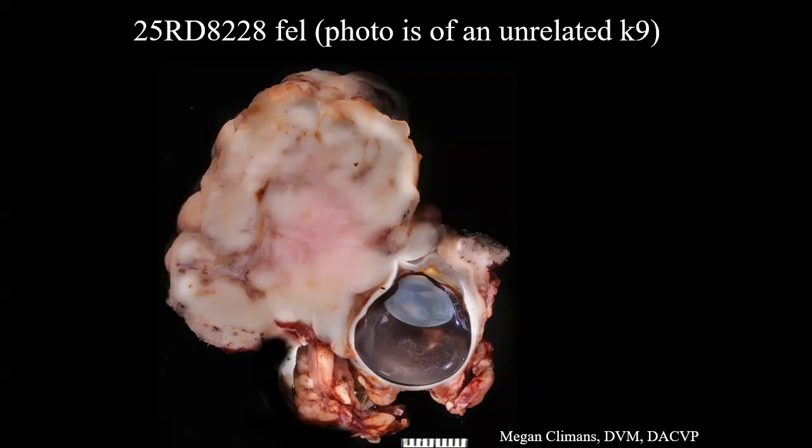But our actual case is a cat, a 10-year-old spayed female domestic shorthair. They said that the globe looked normal, but it was exophthalmic with ventral displacement. The CT scan showed soft tissue mass dorsal caudal to the globe with fluid around it, which was brown. And that's pretty much the history that we got. So we have a dorsal mass, which is displacing the globe ventrally.